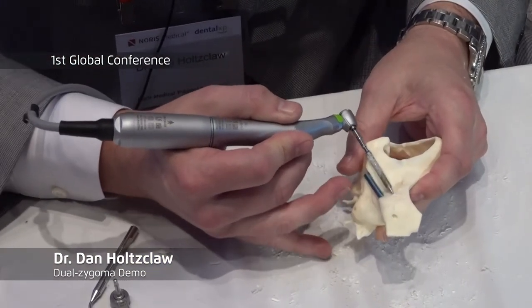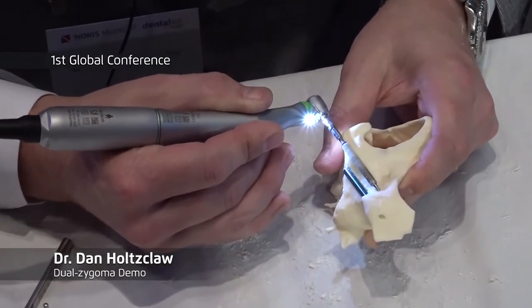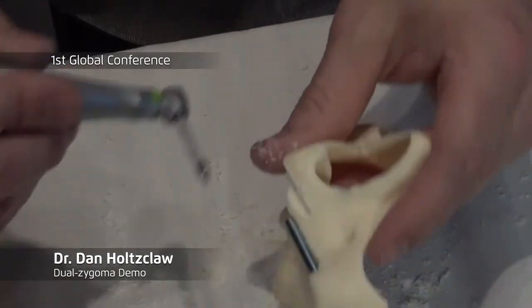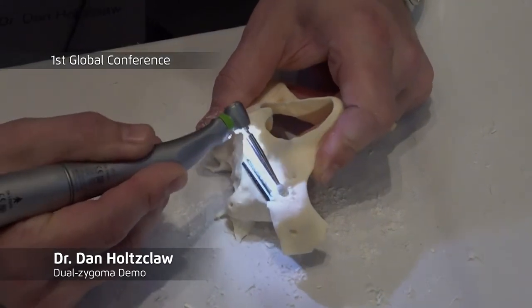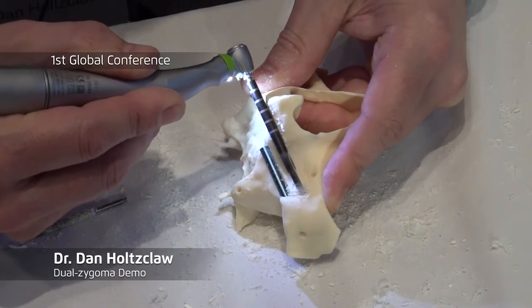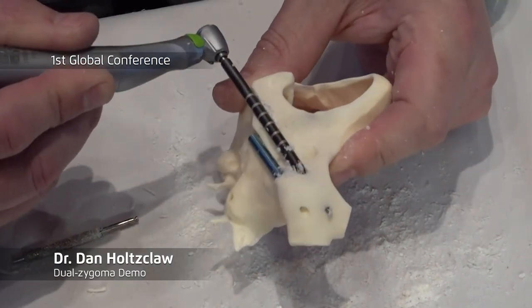Normally if you're doing a quad, the second implant — the more anterior implant — will come out on average about the lateral incisor. All I'm trying to do is make a little mark just so I can see which direction I'm going. I want to deepen this into the bone to have less of this exposed. Now I take this round diamond up here — usually in real life you'll be into the sinus very quickly here. I'm palpating the eye, trying to stay relatively parallel to the implant, and now I would drill through.